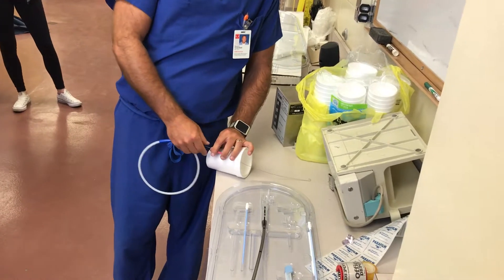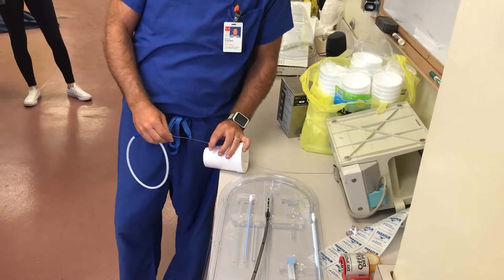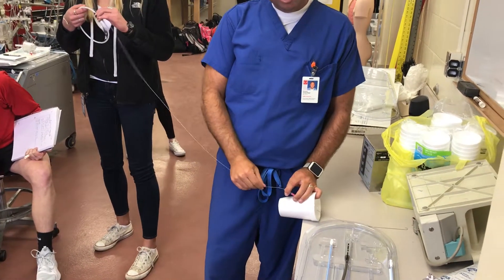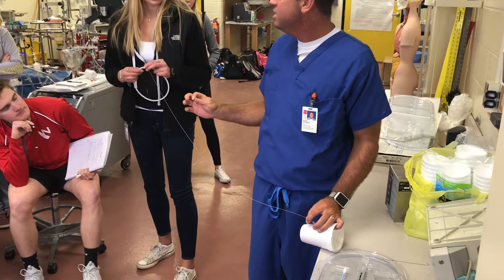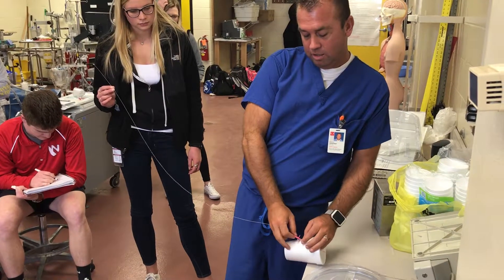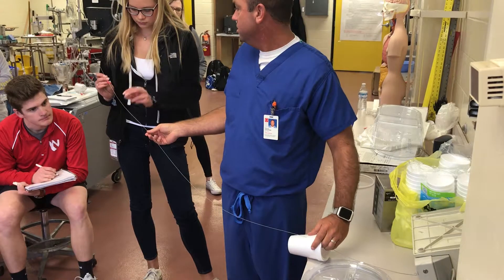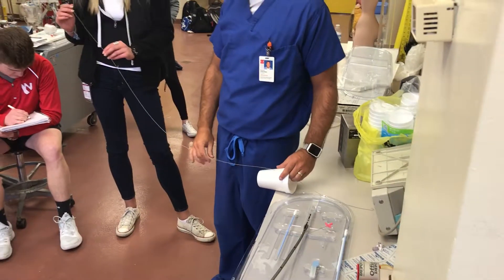So now the wire is going down into the vessel — in this case a femoral line, going all the way in. I'm going to need an assistant. Once we get that wire threaded, we go ahead and take the needle all the way off. Liz will hold the wire. Now I'm acting as the surgeon, and Liz is going to thread a series of dilators over the wire. We take the needle out and now we have just the wire remaining in our vessel.